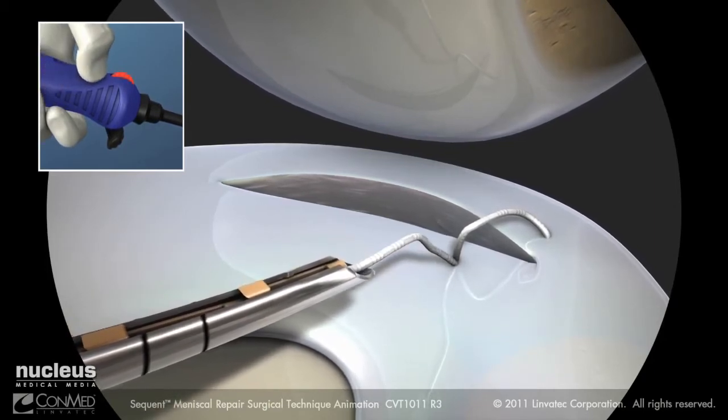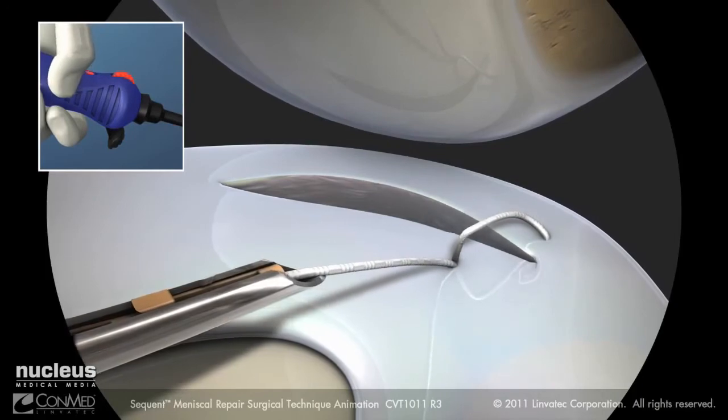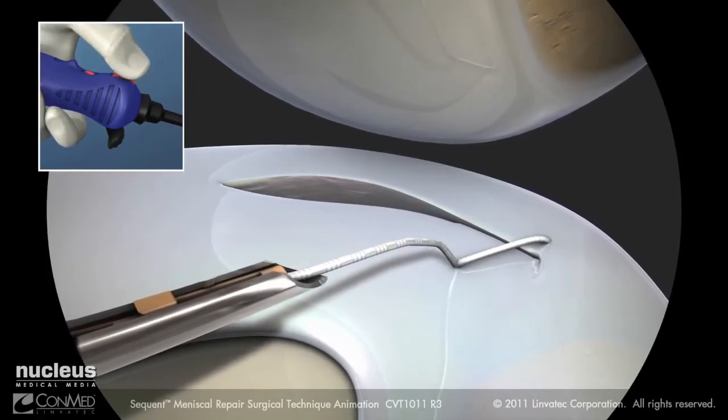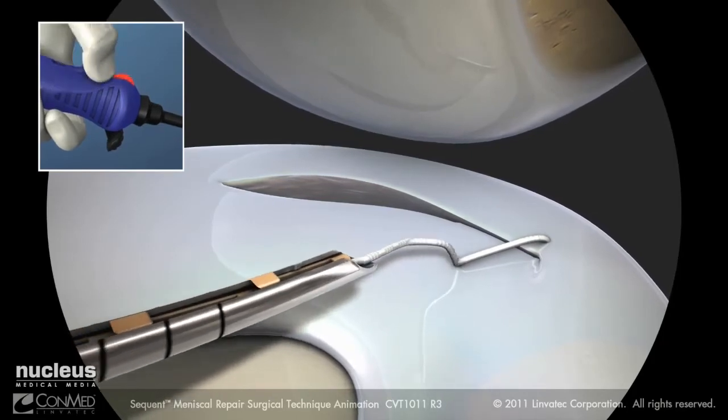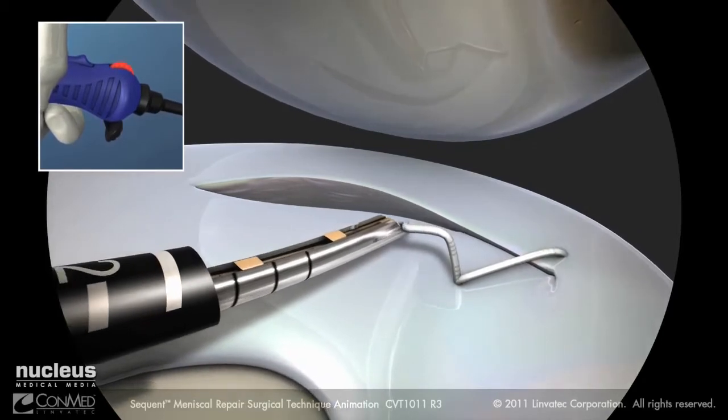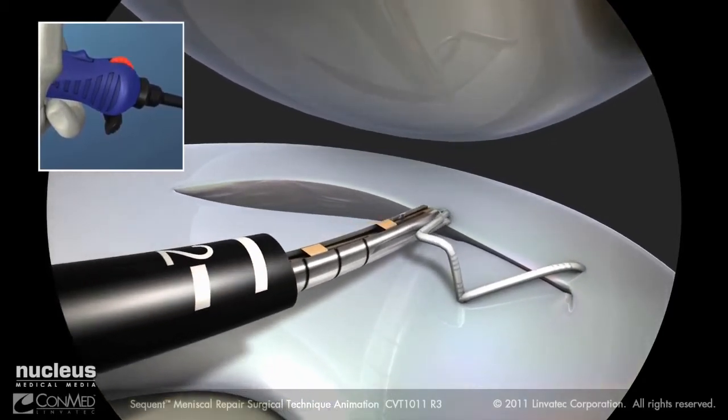Move the switch into the ratchet position. Pull back to tighten the stitch and reel the suture in to remove excess slack. Move the switch into the freewheel position. Repeat the steps to create multiple sequential stitches.